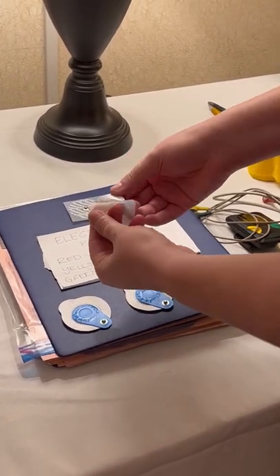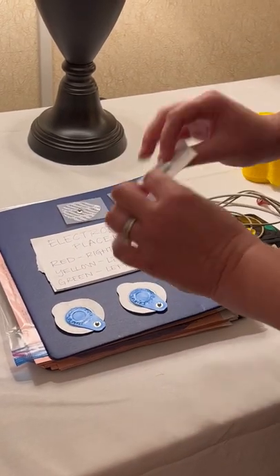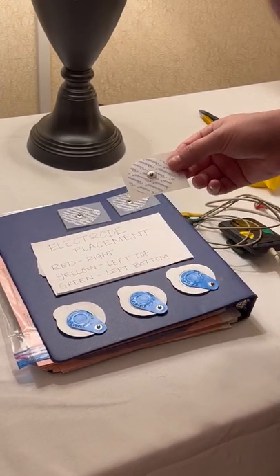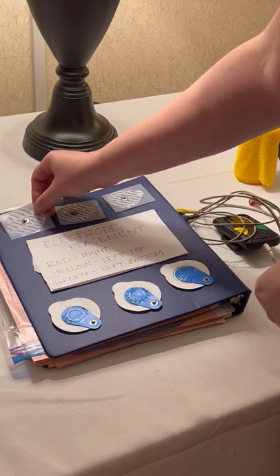They all have a self-adhesive sticky side on the other side. There is a little bit of gel already in place underneath the sticky. We usually put a little dab of gel if we have it — if not, it's okay, you still get a good reading. So those are the electrodes.